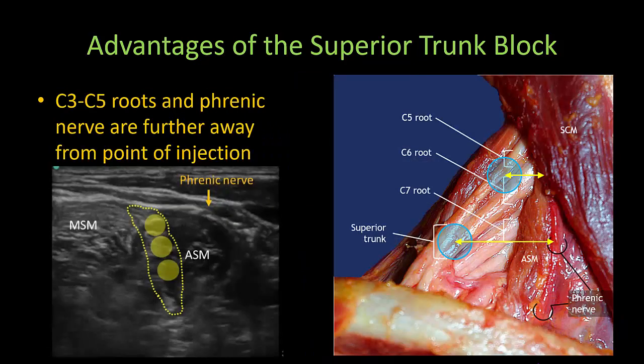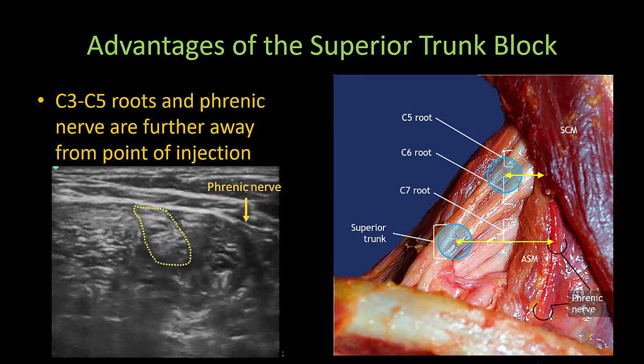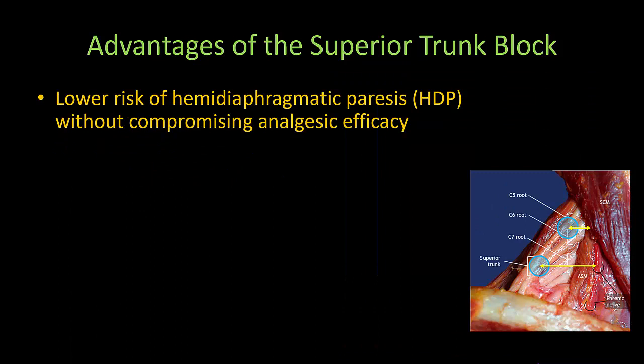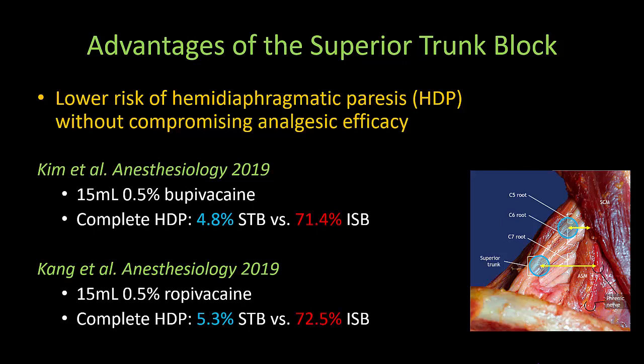A very important advantage of the superior trunk block is that the C3 to C5 roots and the phrenic nerve are significantly further away from the site of injection. This video shows how the phrenic nerve slides medially away from the plexus over the anterior scalene muscle as we descend to the superior trunk level. The superior trunk block thus reduces the risk of hemidiaphragmatic paresis without compromising analgesic efficacy. Two randomized controlled trials comparing both blocks with 15 milliliters of local anesthetic found complete hemidiaphragmatic paresis in 72% of interscalene block patients — with 100% having partial or complete paresis — compared to only 5% complete paresis after a superior trunk block.